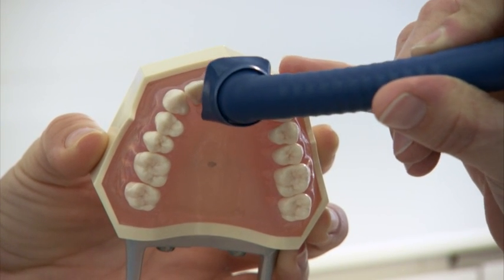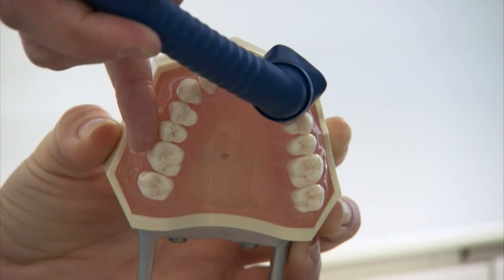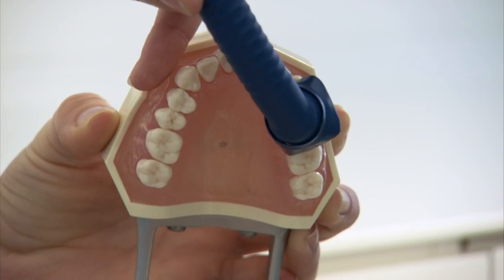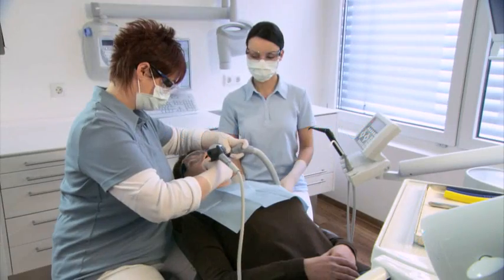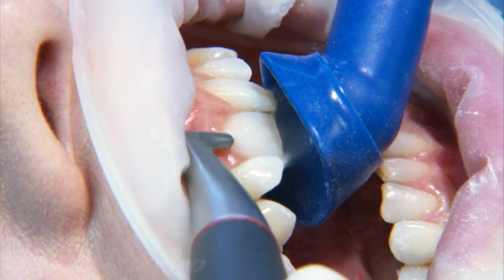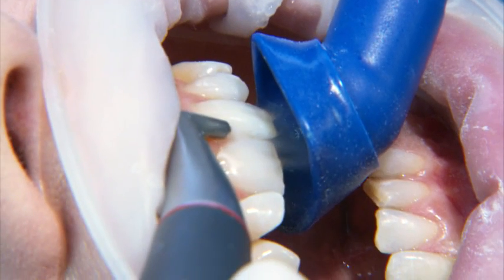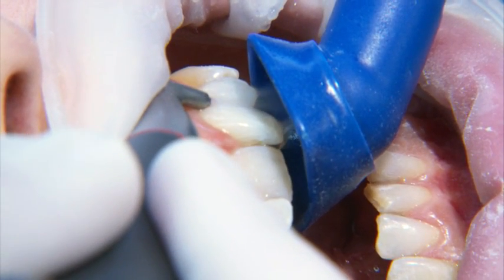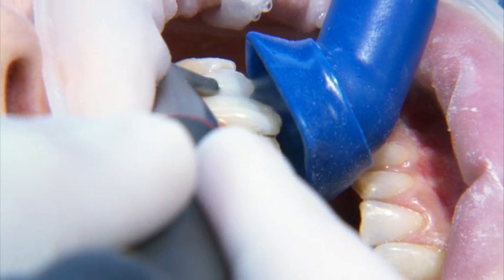It is helpful to practice using the Prophylaxis cannula in the different suction positions on the tooth model. The Prophylaxis cannula was designed specifically for the demands of professional tooth cleaning. The distinct side of the shield perfectly channels the suction stream, and the high aerosol uptake also makes the Prophylaxis cannula ideal for treatment without assistance.